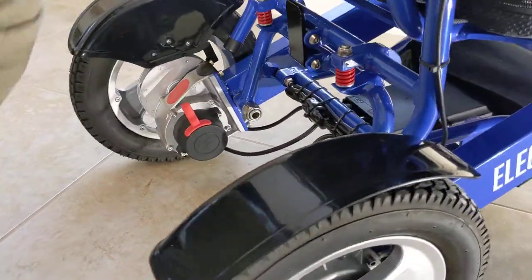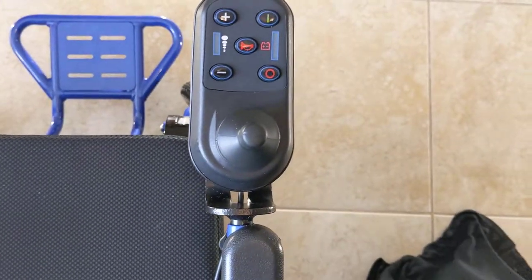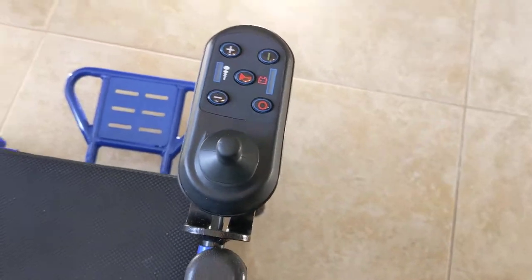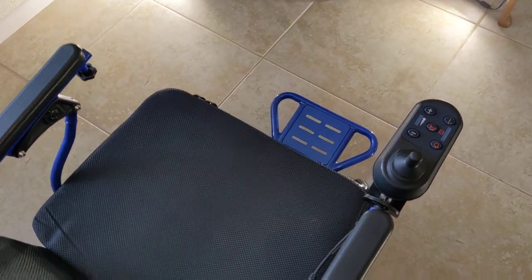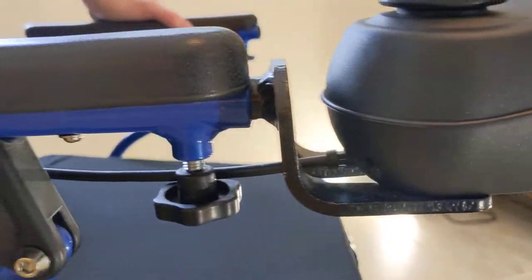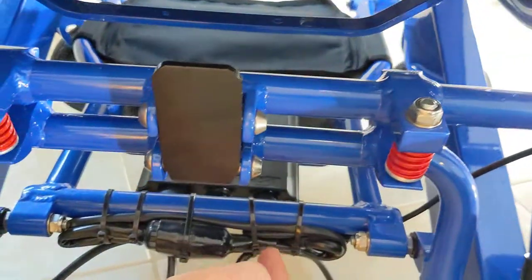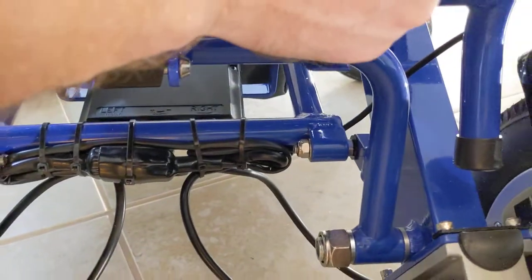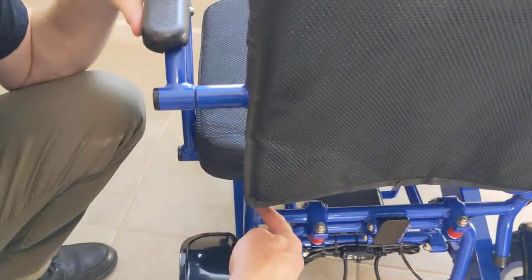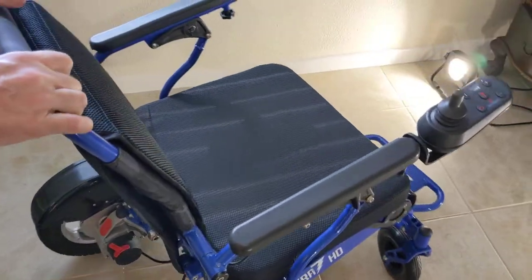The joystick is mounted on the right-hand side of the chair from the factory, but it can be moved to the left. A knob underneath the chair mounts the joystick, and there are cables underneath that allow you to liberate some slack, remove the joystick cable from the right side, and attach it to the left side with a couple of zip ties — approximately a five to ten minute process.